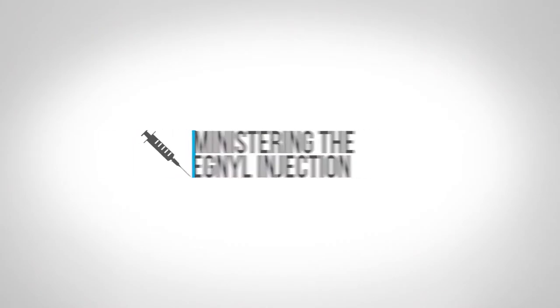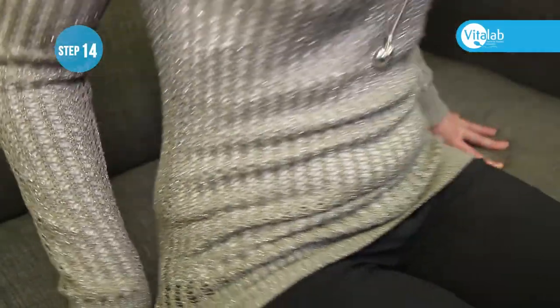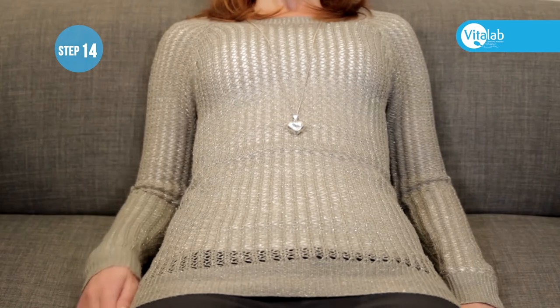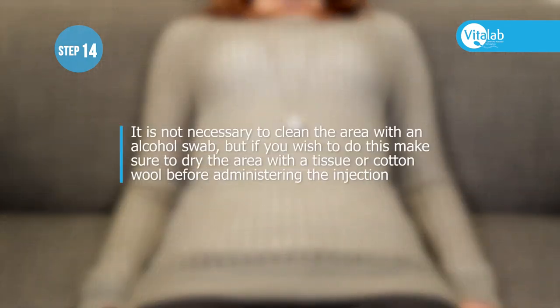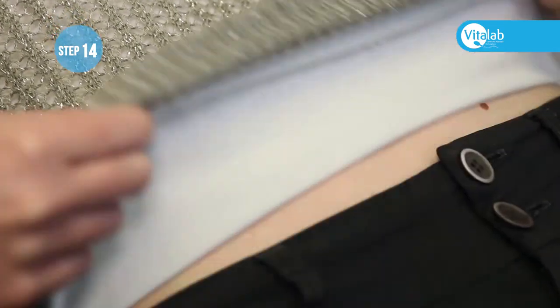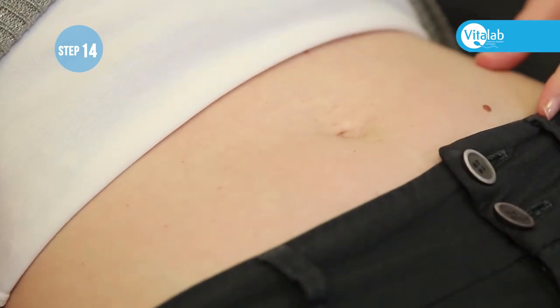The best position for administering an injection is to sit in a chair and lean back comfortably. It is not necessary to clean the area with an alcohol swab, but if you wish to do this, make sure to dry the area with a tissue or cotton wool before administering the injection. The injection can be administered anywhere in the abdomen, in the area below the belly button.